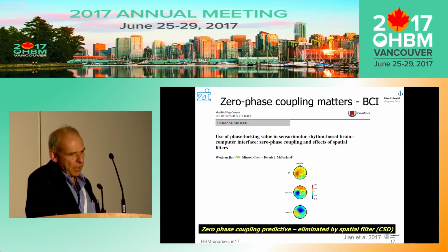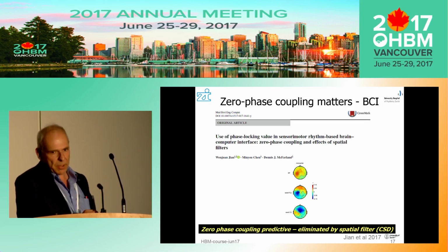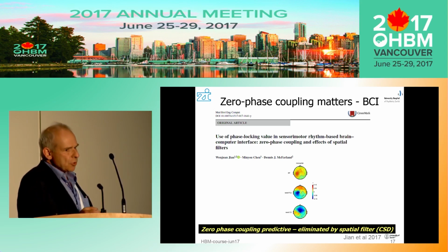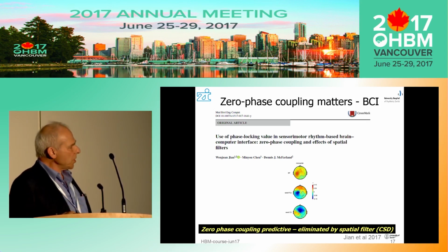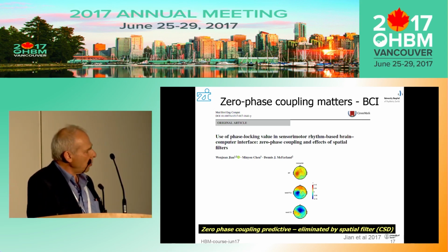And if we find methods that eliminate volume conduction and along with volume conduction also eliminate zero lag true connectivity, then you're losing prediction. So it can be physiologically quite meaningful.